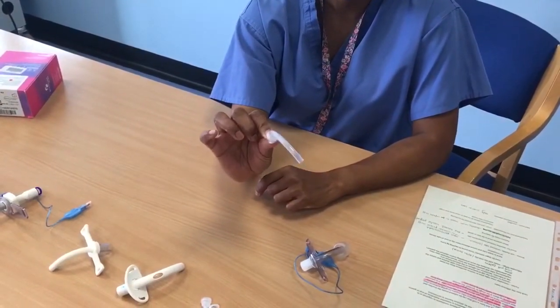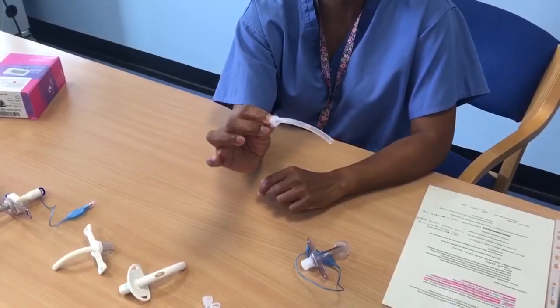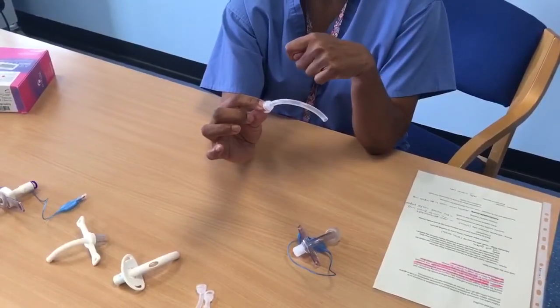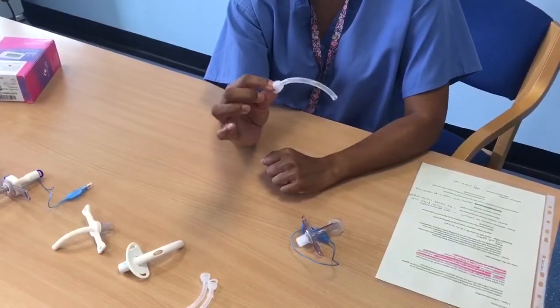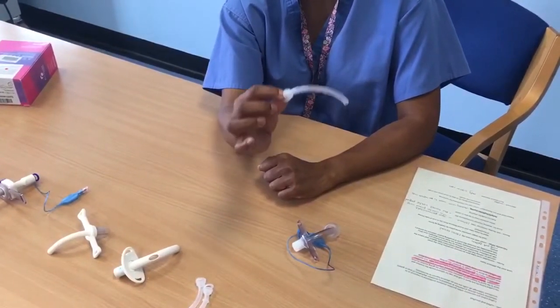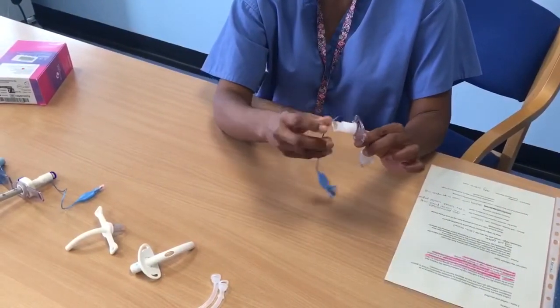Now, we need the inner tube to allow us to clear the airway, to give suction therapy. One of the issues with having an inner tube is that it can become full of secretions. So it's recommended within NHS Lothian that we clean the inner tube every 4 hours and replace it with a clean tube. So there should always be a spare tube beside your patient. I'm just going to pop that one back in.